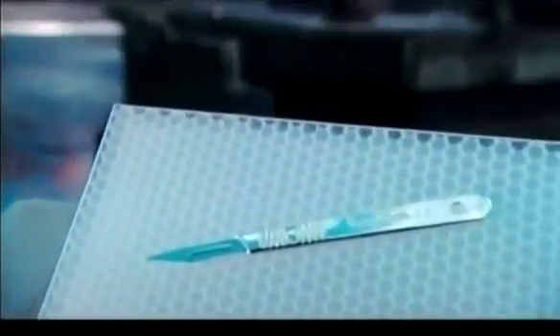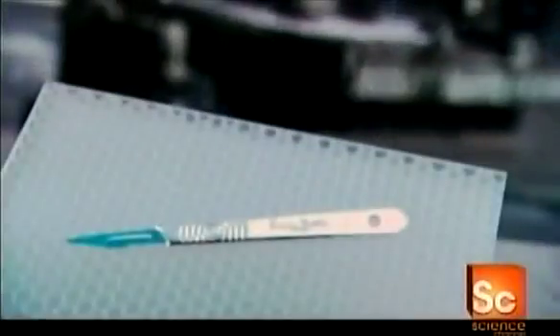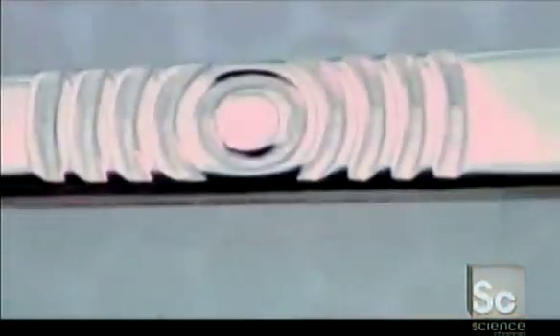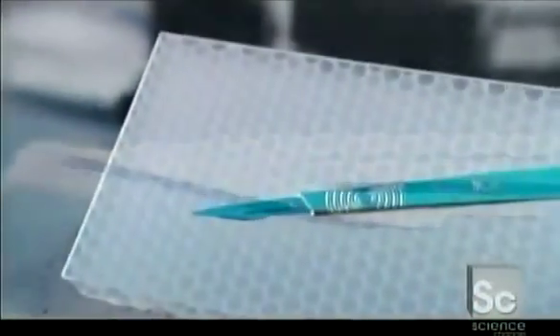The scalpel is the surgeon's trademark tool. Its short blade is razor sharp and designed to slice swiftly and cleanly. This little knife may seem like a simple instrument, but its incredible precision, along with the surgeon's steady hands, is key to a safe and accurate medical procedure.